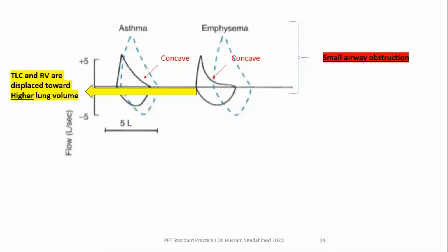Now, نجي to the most confusing points, that is, let's look at them in the flow volume loop. In the flow volume loop. بنفس الطريقة تكلمت عنها. Usually the degree of obstruction is determined by the concavity اللي هي by the scooped end. كل ما كان obstruction more severe كل ما كان this is more scooped. طيب this is number one.